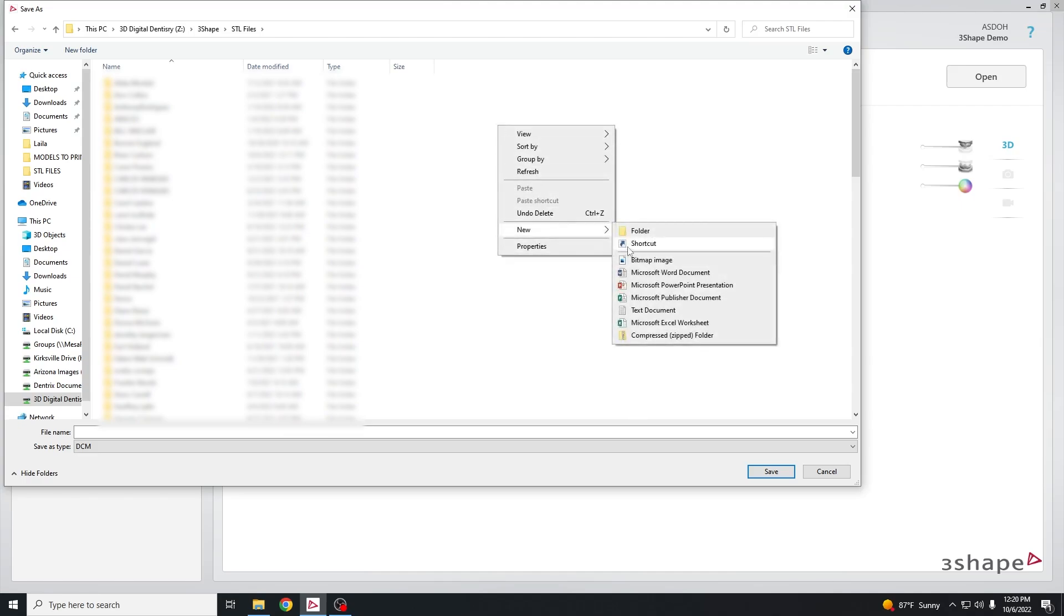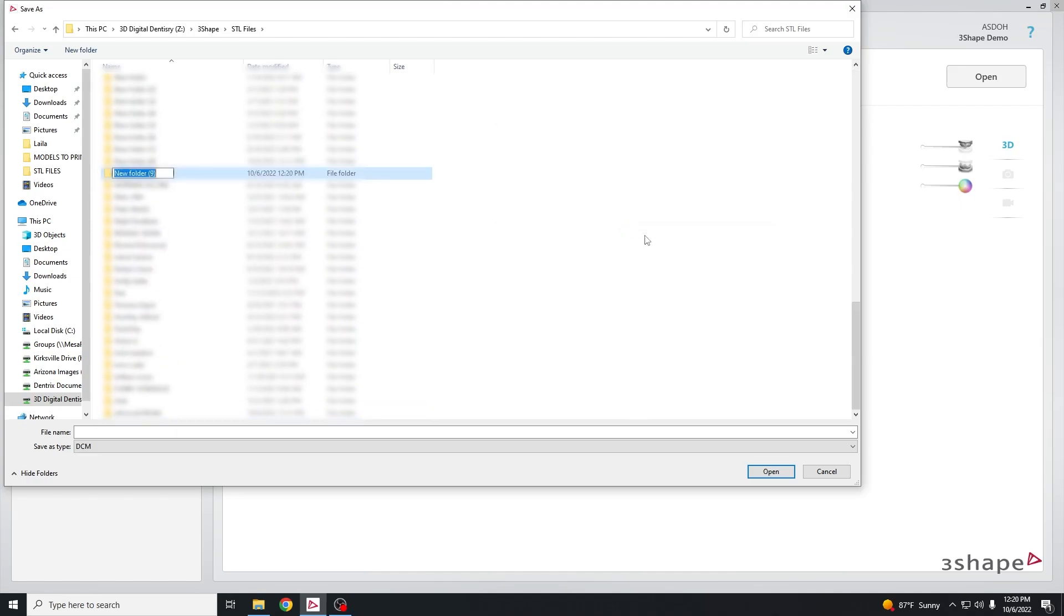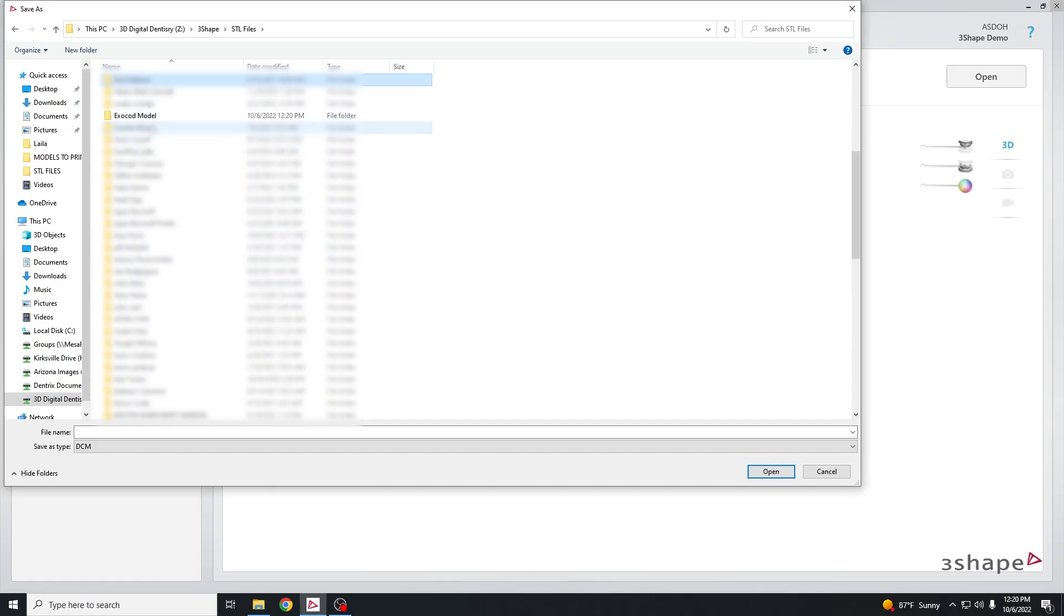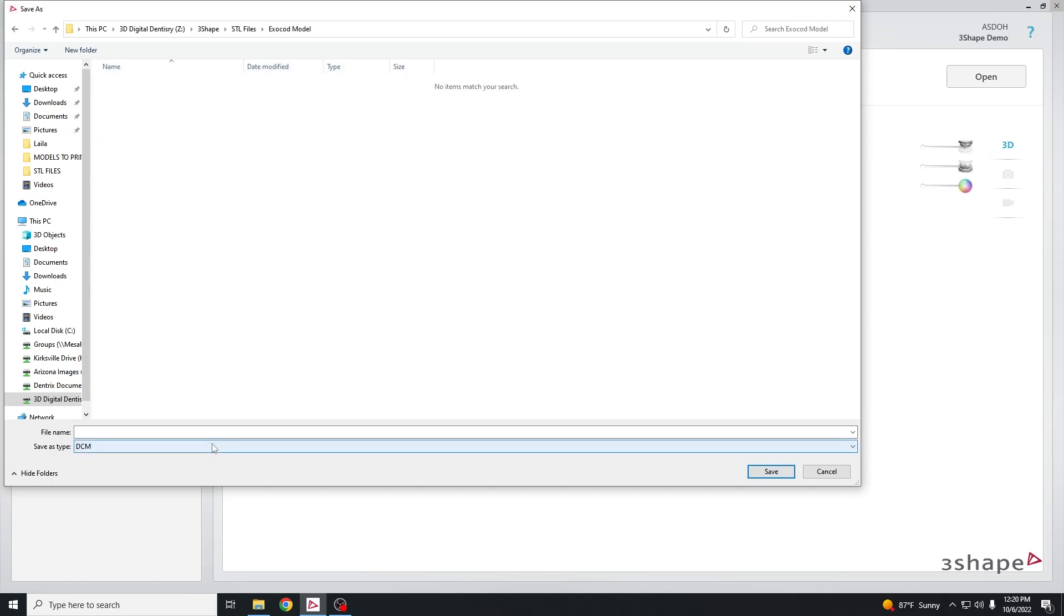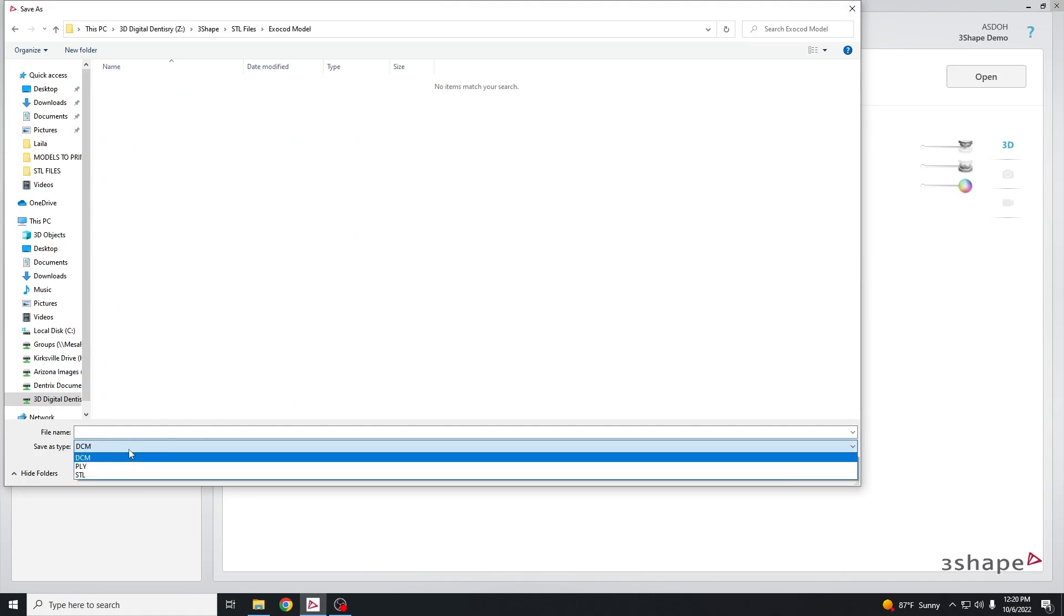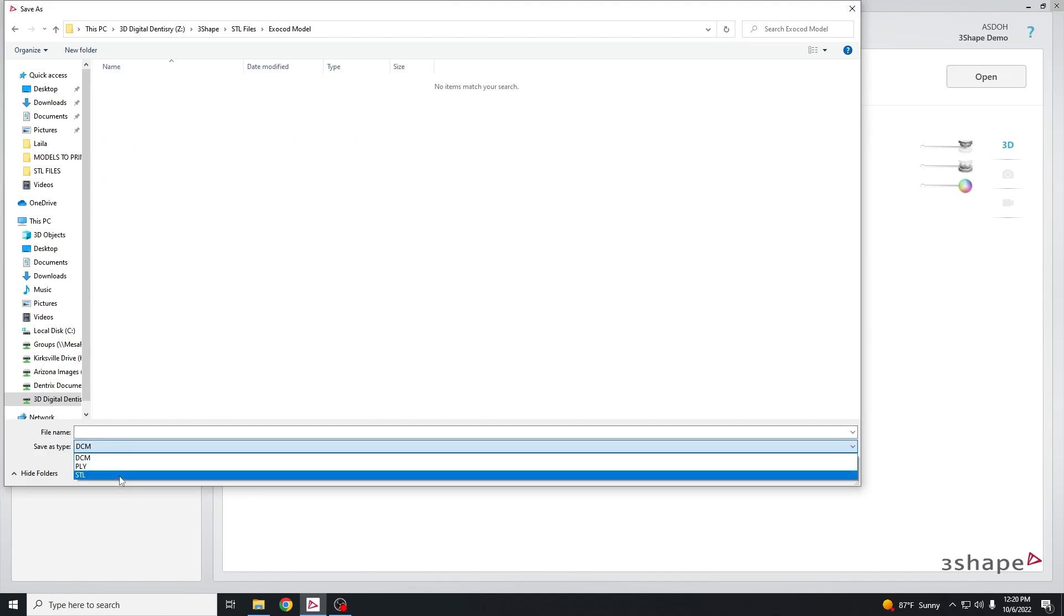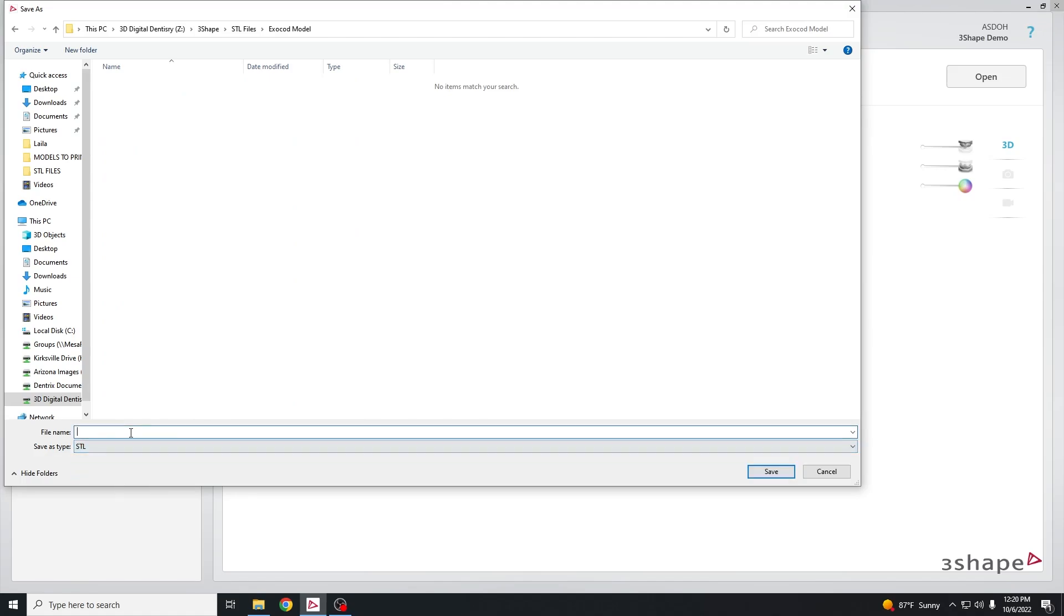Create a new folder and we'll call this Exocad model. Click on that folder, then change save as type to STL and label this with your patient's initials or their name, then hit save.